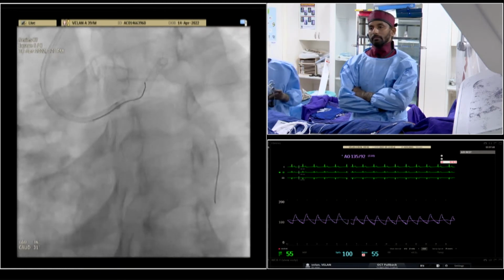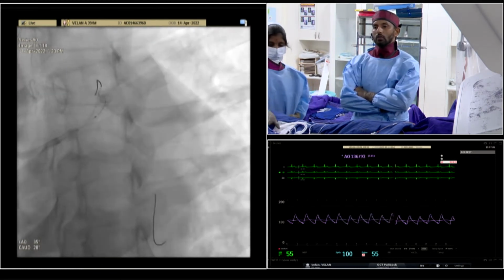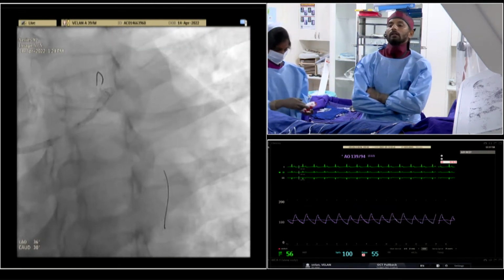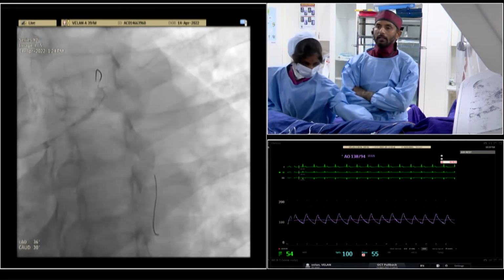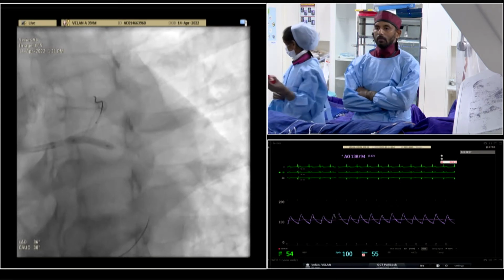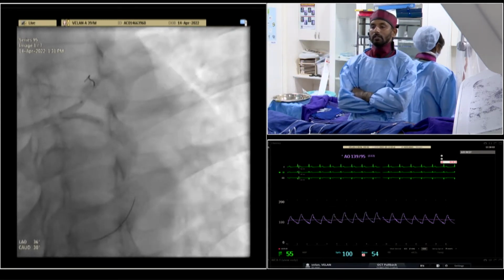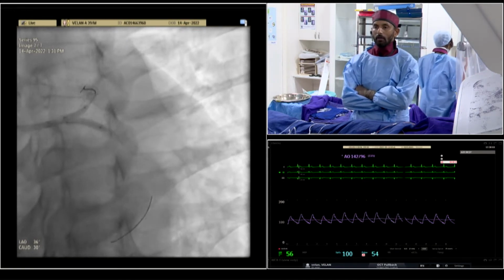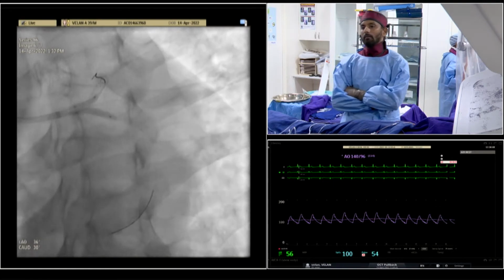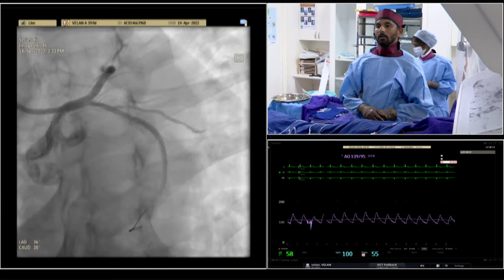And the next one. And this stent boost showed me that my wire has crossed through the stent struts and not through the lumen of the stent. So then I did a first kissing balloon inflation, so sequential inflation to the LAD with a 2.75 balloon and a 3.5 into the circumflex. And this is the first kissing inflation with the same 2.75 and a 3.5 into the circumflex at 12 atmospheres. And stop. And now I removed the wire. I'm taking one last picture after removing the LAD wire and balloon, and this is what we got.